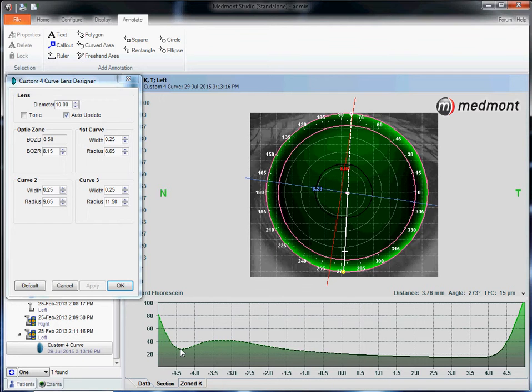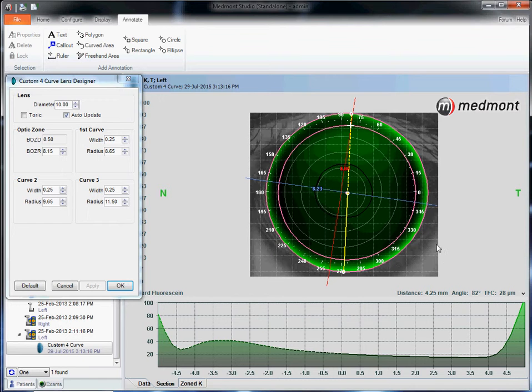At the edge of the optic zone where the peripheral curves begin to kick in, somewhere around this spot, we could click our cursor on the inner pink circle. That's the edge of the optic zone. This patient has 28 microns of fluid superior, heading inferior 19.